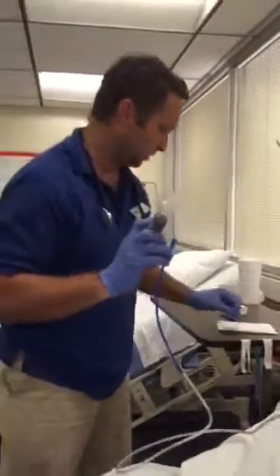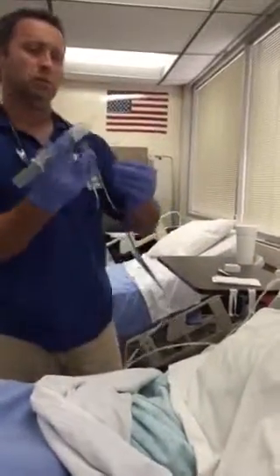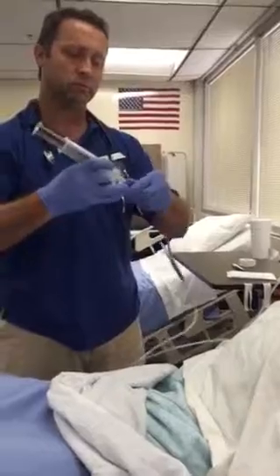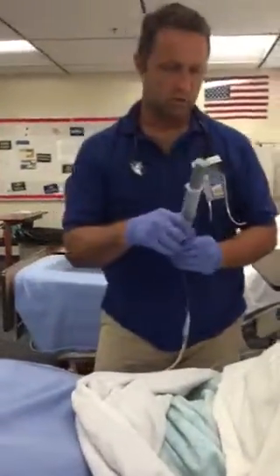We're going to take our little pH paper. We're going to test it because we're expecting a response back. Let that dry there for a second. We're expecting a response back that says, yeah, that was the stomach, most likely. And we got the color indicator that we wanted, suggesting that it is the stomach.